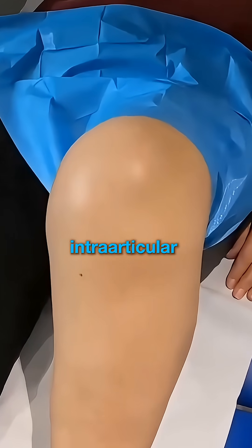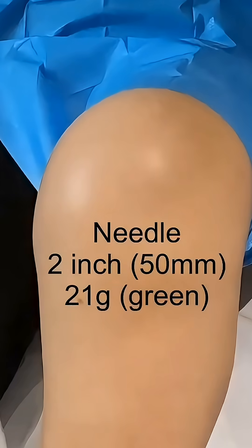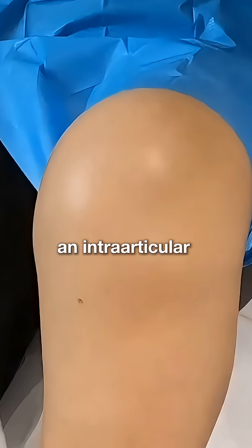This video demonstrates an intra-articular knee injection using the anterior approach. You will need a needle of at least 50mm in length in order to reach an intra-articular depth.